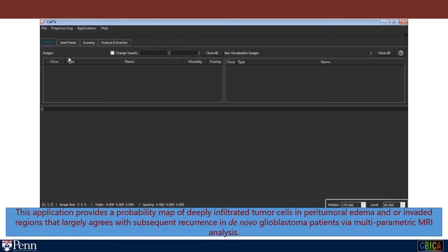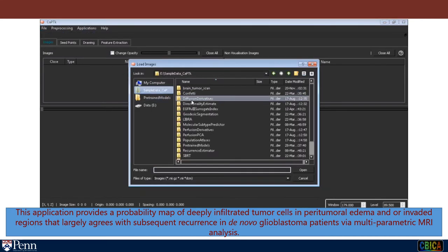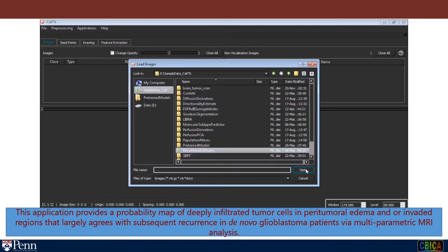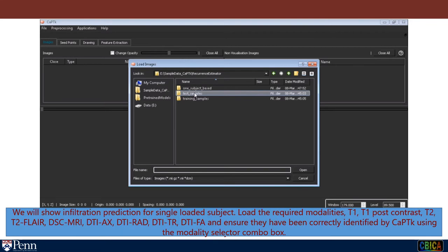This application provides a probability map of deeply infiltrating tumor cells in the peritumoral edema and/or invaded region, which largely agrees with subsequent recurrence in de novo glioblastoma patients via multiparametric MRI analysis. We will show infiltration prediction for a single loaded subject.